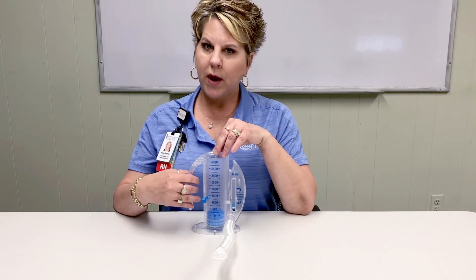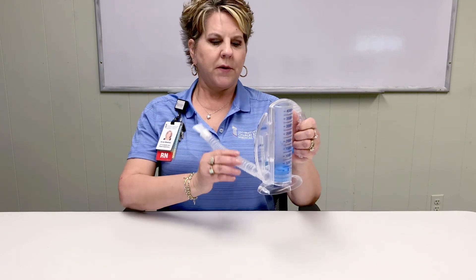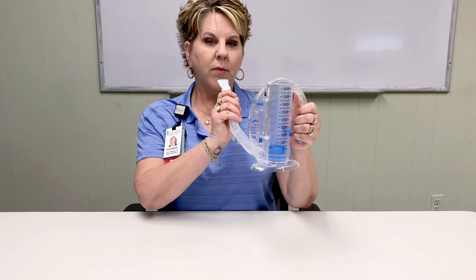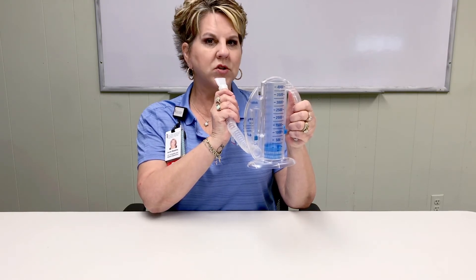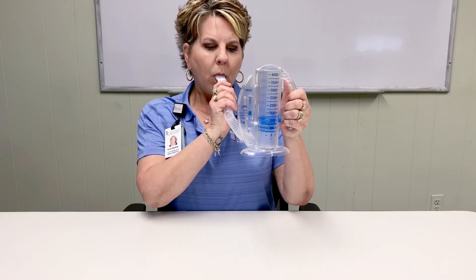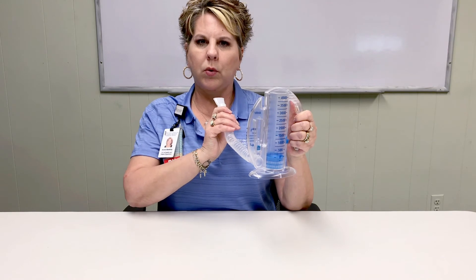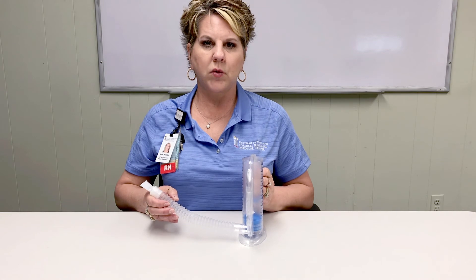And now I am going to show you how to use the incentive spirometer. Sit up straight. Hold the incentive spirometer in an upright position. Big breath in. Exhale. Form a seal with your lips around the mouthpiece and slowly inhale, much like sucking on a straw. Holding your breath those 3-5 seconds at the end and slowly exhaling.